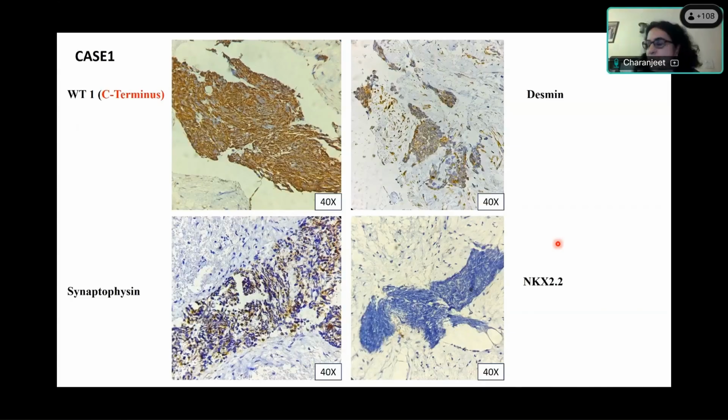What IHC panel will you order? What IHC panel will you order?